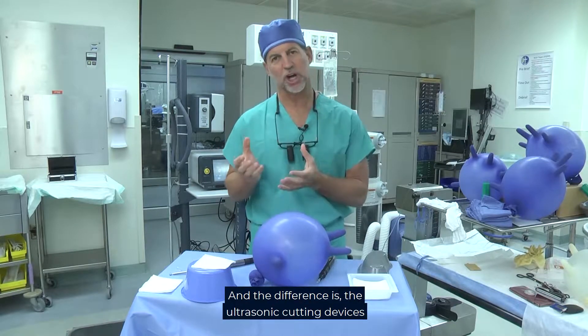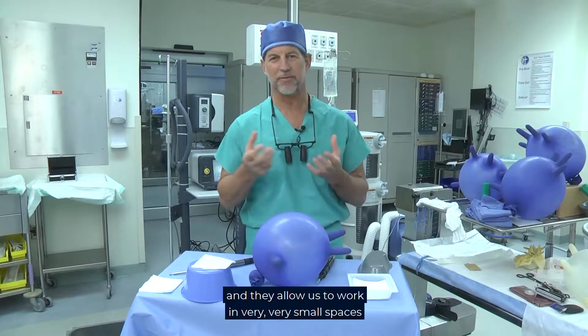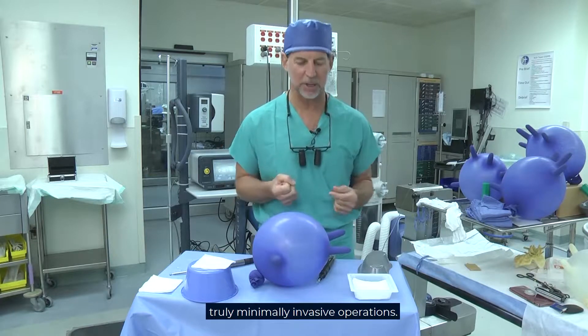The difference is the ultrasonic cutting devices don't have sharp edges, they don't spin, they don't tear, and they allow us to work in very, very small spaces so we can do much less aggressive, truly minimally invasive operations.